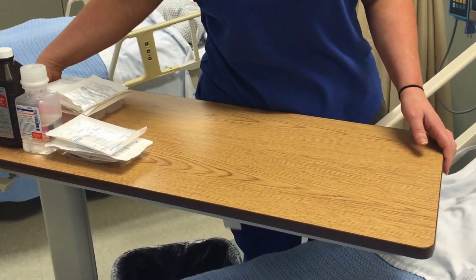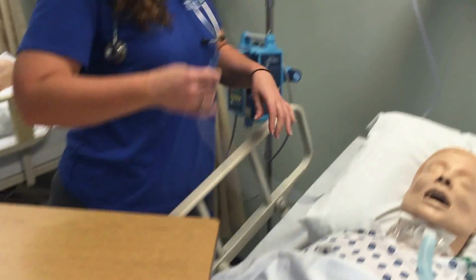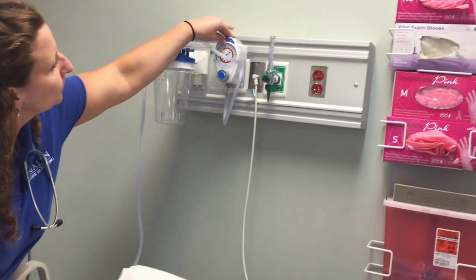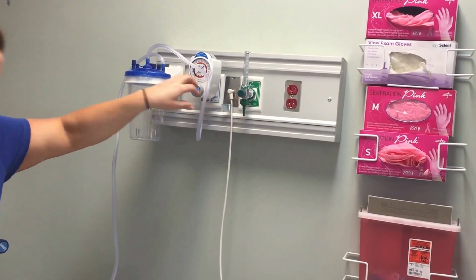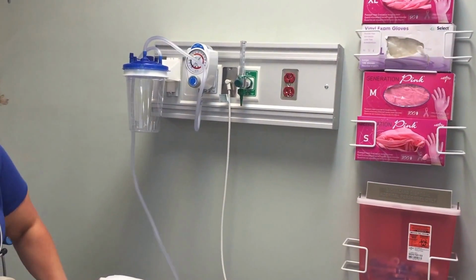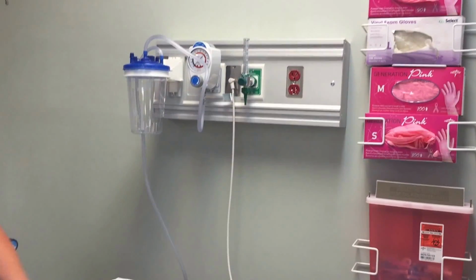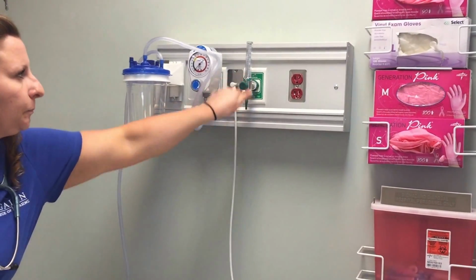Tray table, bedside table's up. All right, I have my suctioning tubing here. It is turned on. And I'm going to turn it up to where it says 80 to 120, around in that range. And then I'm going to go ahead, as I set everything up, and hyperoxygenate my patient. And we'll crank it up here.